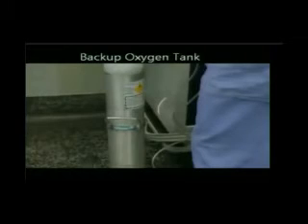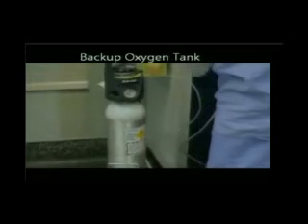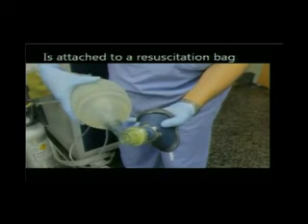So now I go to the backup oxygen tank. This is necessary for a variety of reasons, including the possibility that the main oxygen supply might fail. So in this case now, Professor Hung checks the backup oxygen tank and verifies that the tubing is attached. And that is also attached to a resuscitation bag. Now please stop. This is a different bag than the first thing I showed you, which was the anesthesia circuit.